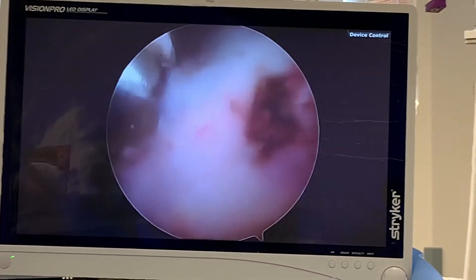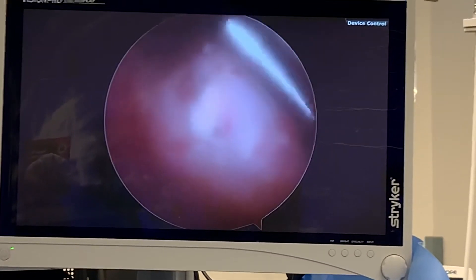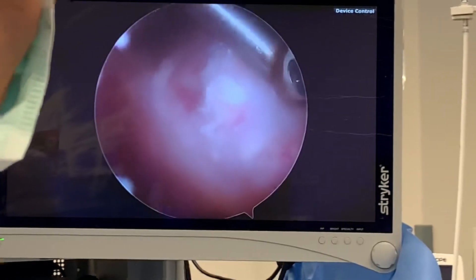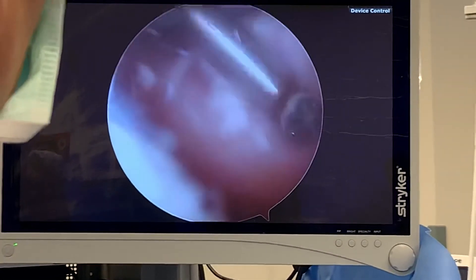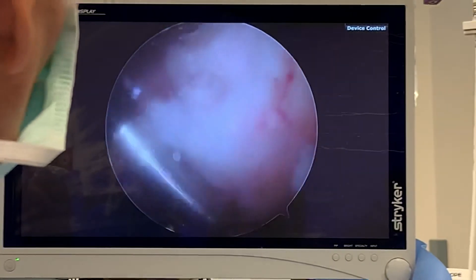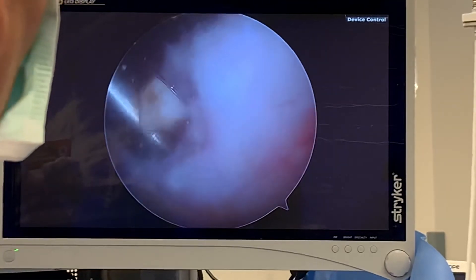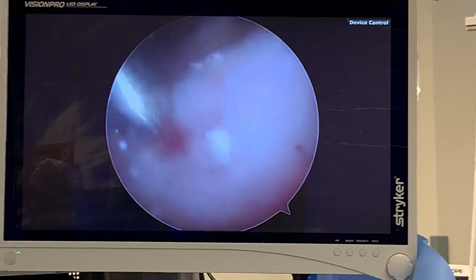I'm going to make sure there's nothing else. Wait a minute — let's go over here, there might be some more. Yeah, look at that. It's like popping a pimple, I'll be honest with you — that's what it feels like I'm doing here. But it's actually important to get it all out because it's very irritating to the joint. So I'm going to continue my work here to get rid of this calcific tendonitis deposit, and then I'm going to fix this patient's rotator cuff tear. I can tell you right now, just removing this very painful deposit of calcium is going to make it feel better.